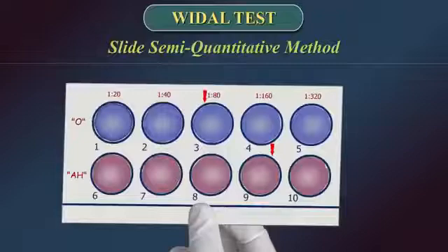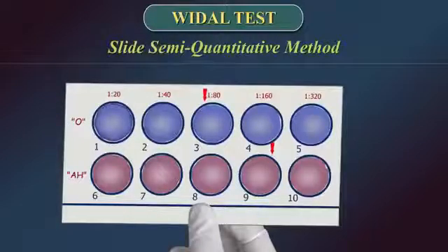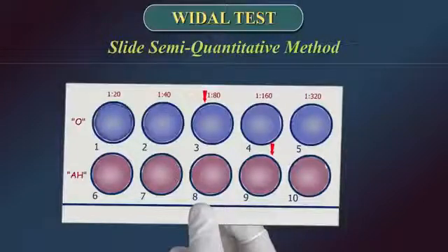Interpretation of result: Agglutination is a positive test result. The titer is reported as a reciprocal of the highest dilution which shows a positive test result.